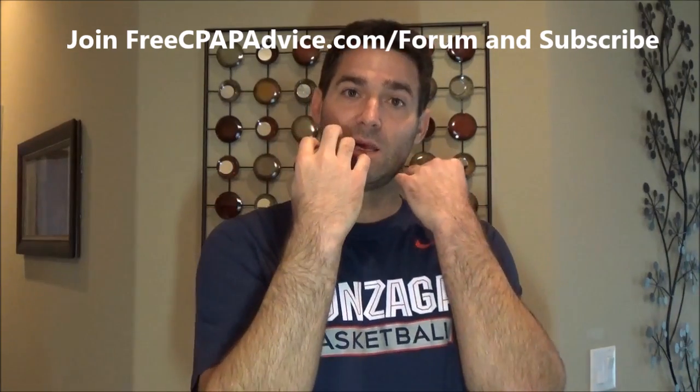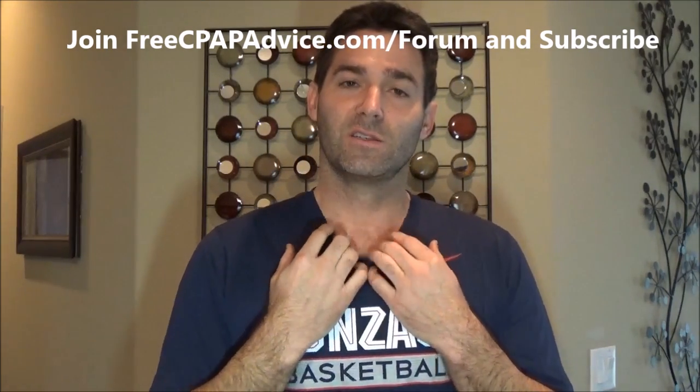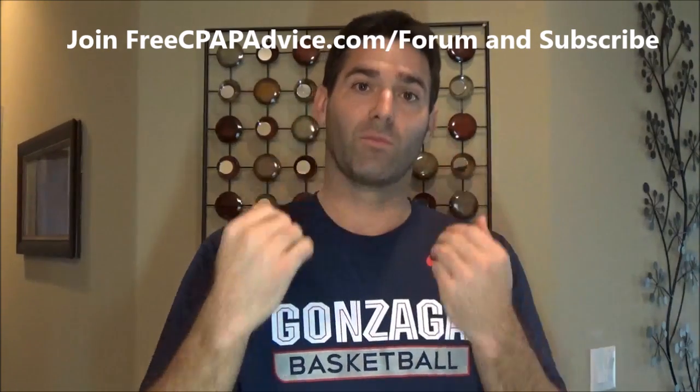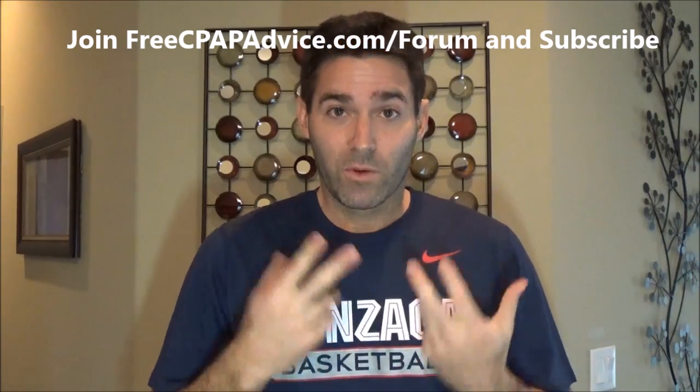When you exhale, it lessens up on the blowing, but that constant pressure is maintained. So even though CPAP doesn't actually blow in air, it tries to get rid of that void when you inhale by moving more air into it. So during those periods, you are having higher amounts of airflow. This is going to overwhelm your nose. Your nose is not meant to breathe in like you got your head out the car window, going 60. It's just not meant for that. So it needs a little help in humidifying the air. And that's where the humidifier comes in.